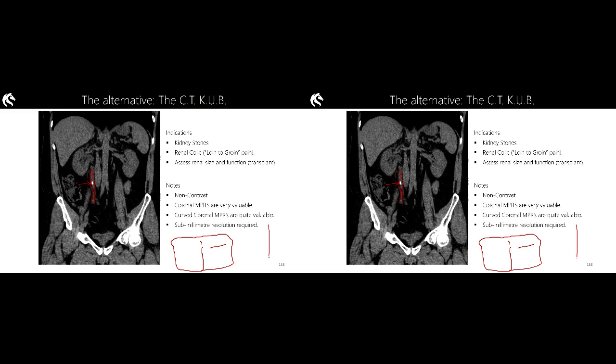looking at it from above. Now, if we had a very sharp, very fine knife, and we do, there's no reason why we couldn't cut our slice of bread in a series of curves, is there? So all of our slices cover a curved structure. No problem. When would that be useful?